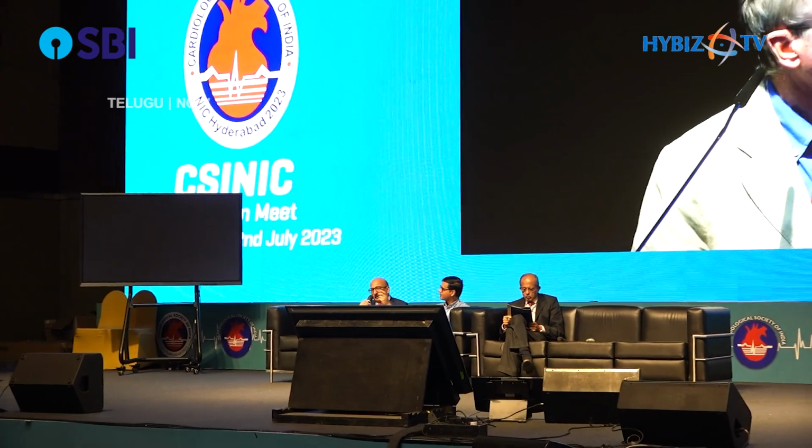Colombo, I think these are extremely important points which you raised about how to treat an ostial circumflex disease, because sometimes it is de novo and at times it is because of a sequelae of a first stent from left main to LAD. So in both these situations, as you already mentioned, avoiding a stent is a better technique. And what is your idea about using cutting balloons like Wolverine, or any other device, if it is very calcified, even a shock wave, and then assess whether we need to put a stent or just a drug-eluting balloon?